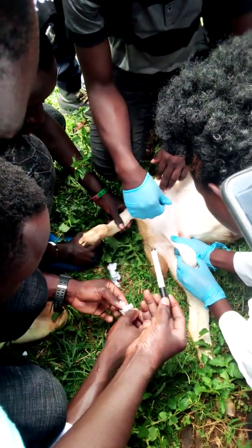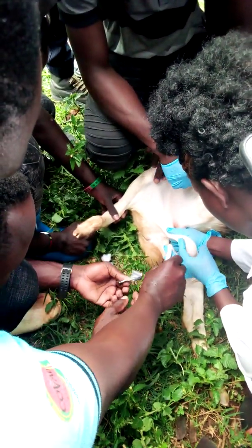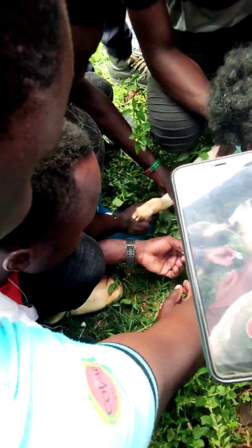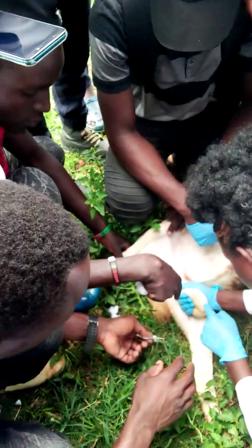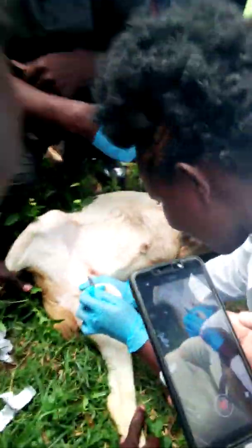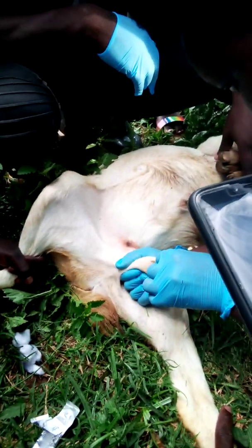Squeeze it very well, but small enough to allow here — vertical. At the sides. The front people should squat them so that the rest can set some pressure here. Yes, some pressure on the testicles.